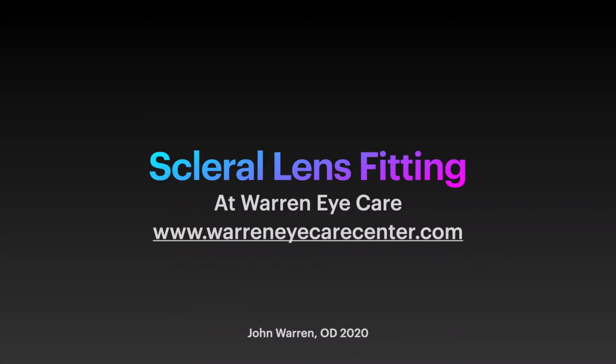Hello, my name is Dr. John Warren. I'm an optometrist in Racine, Wisconsin, and I fit scleral lenses for my patients who have irregular vision and don't see well with regular means.